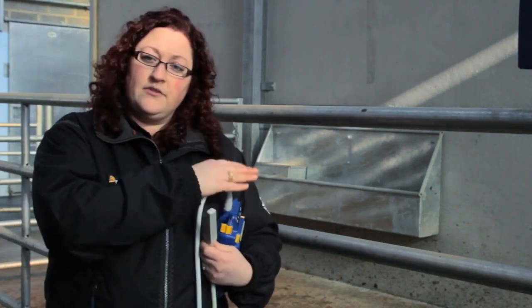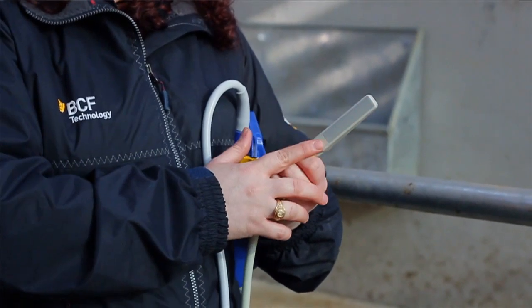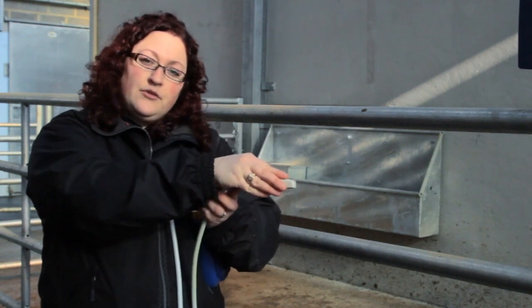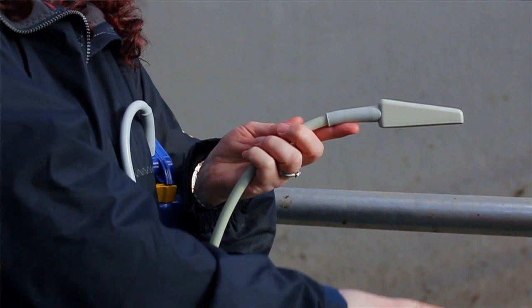That signal is received by the console and translated into an image. The orientation of these crystals means that when the electricity hits them and they vibrate, the ultrasound wave comes down in a line like this.